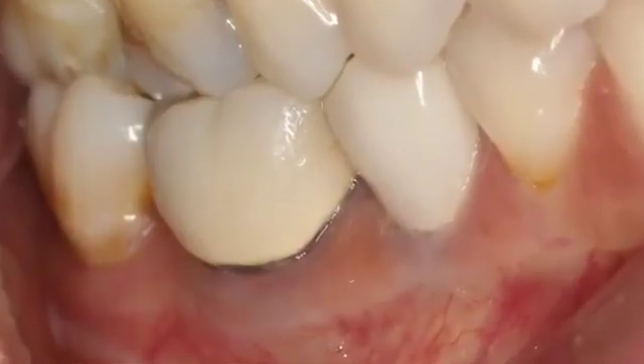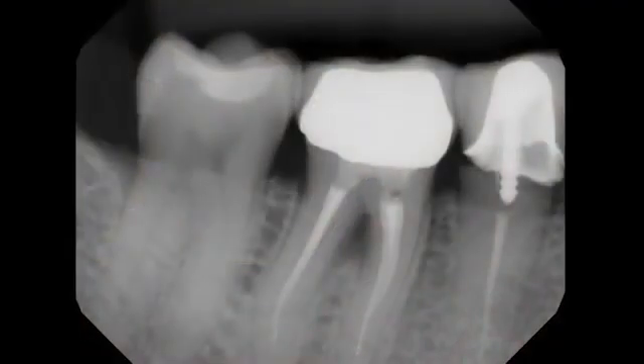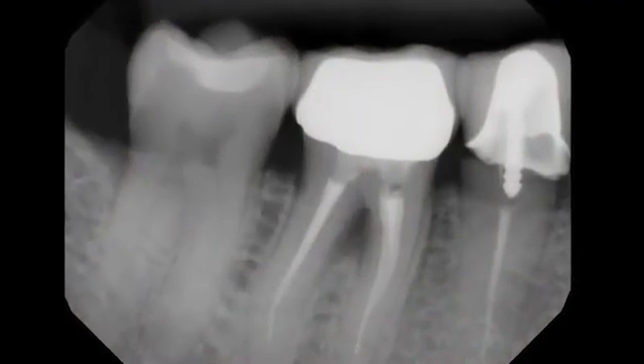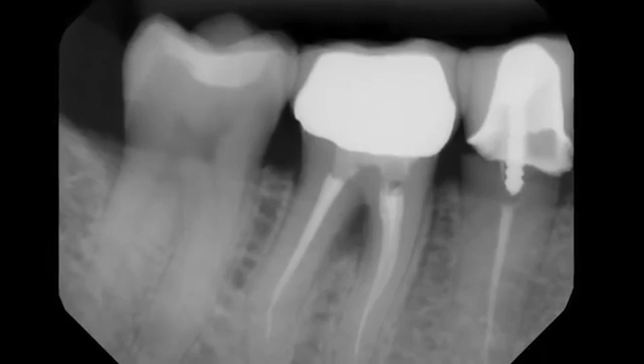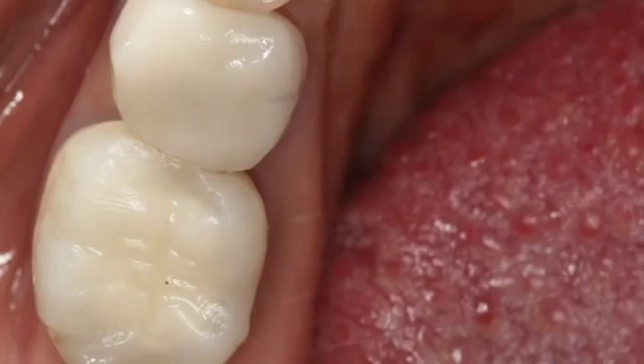We have a mandibular first molar tooth that is deemed non-restorable. We have a vertical fracture in the furcation area, and the patient has symptoms. So we're going to remove this tooth in preparation for a future dental implant.